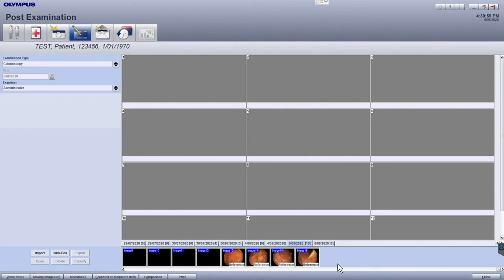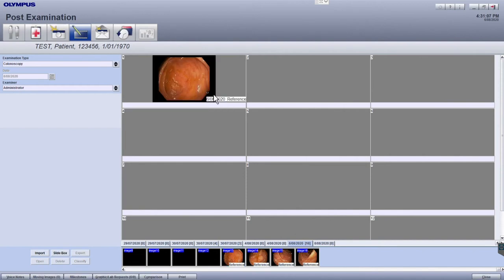To select images to include them in your report, you can either drag and drop them from the filmstrip into the grey boxes, or you can click on the image so it becomes highlighted, and then click on the next available numbered box in the order that you would like them to be displayed in the report.